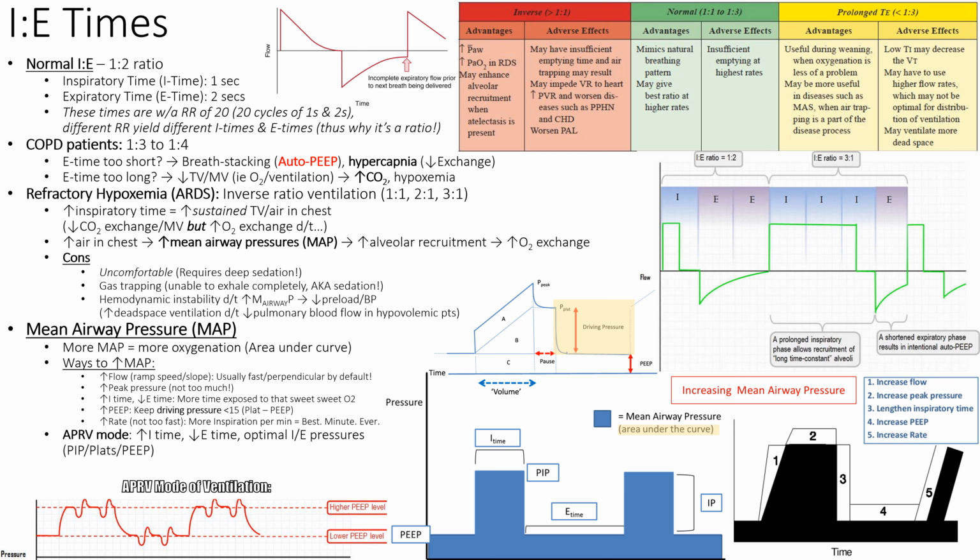All right, so IE times. So we talked about you could change IE times for someone who has auto peeping. So how do you fix IE times and auto peeping?